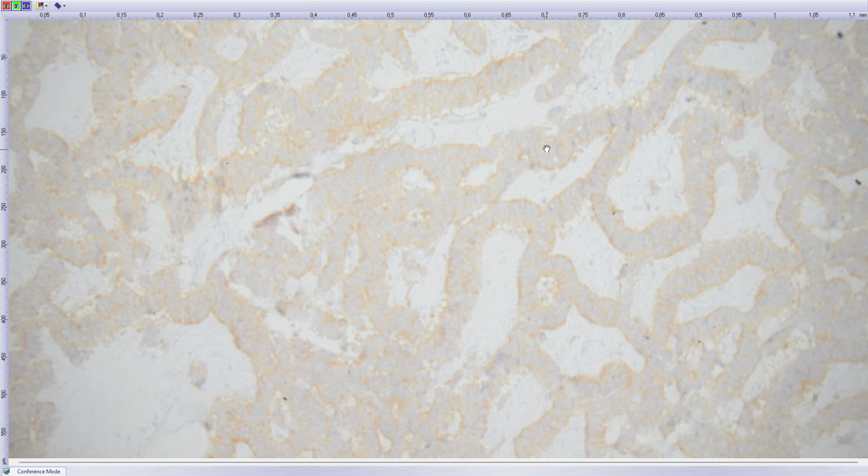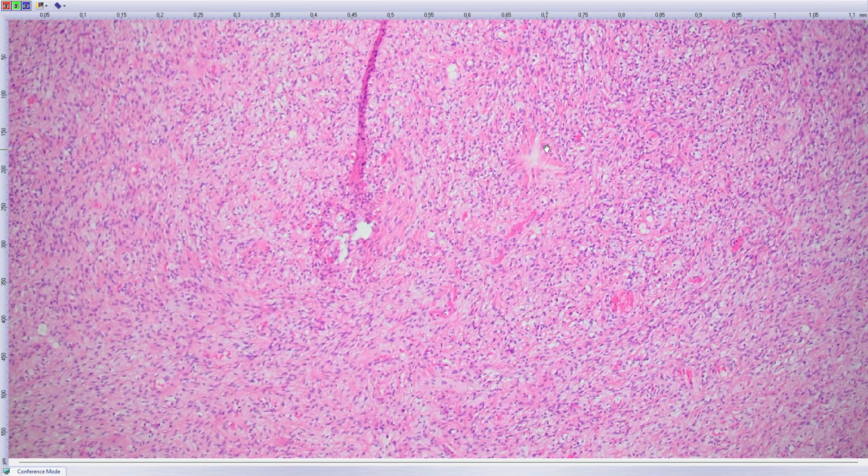Would you have a suggestion for diagnosis? Strumal carcinoid. Yeah, this ovarian strumal carcinoid, which is a unique type to the ovary. It's not seen anywhere else. We have even a couple of malignant cases that grew into undifferentiated mucinous-positive lesions, and they are very often arising in addition to ovarian struma. This is an amazing case. Lesion of the vulva. Another case, I don't remember the age of the patient.